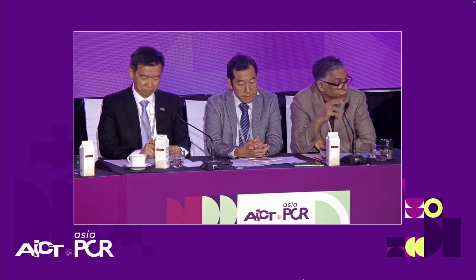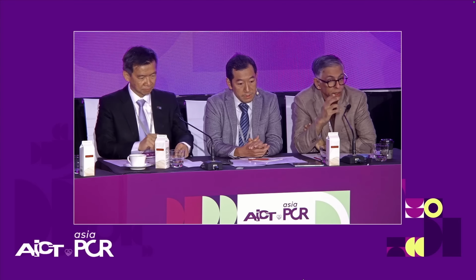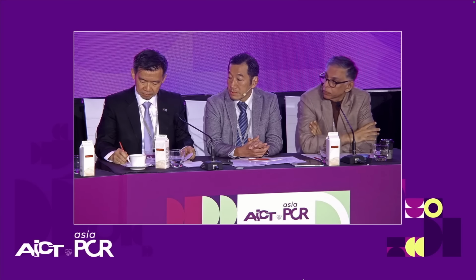Yeah, it is important to be aware that the randomized data, the RotaCut trial, was a negative trial, but what they did is they used 1:1 cutting balloons at low pressure, and so perhaps the pressure may modulate the response to the cutting balloon. Yes, I agree with that because, like I said, the IFU said low pressure, but when I go high pressure, I think I see better results sometimes with imaging.